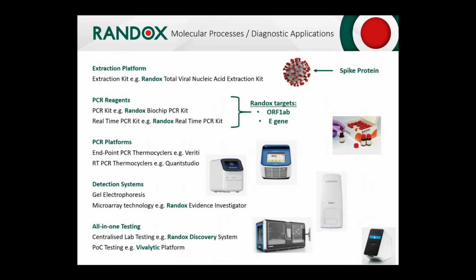Once the samples have been extracted and purified of their nucleic acid, in this instance the single-strand RNA of the coronavirus, the samples were transferred either to short-term storage or to the template addition laboratory. That's where the RNA from the extracted material would be added to the PCR reagents. Just bear in mind, whenever you're preparing your master mix reagents, it's vitally important that your master mix laboratory is located as far away as possible from the amplification detection room to prevent any carryover. Your master mix laboratory must remain biological free.